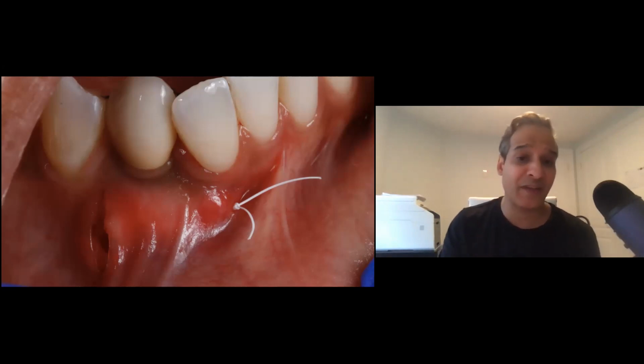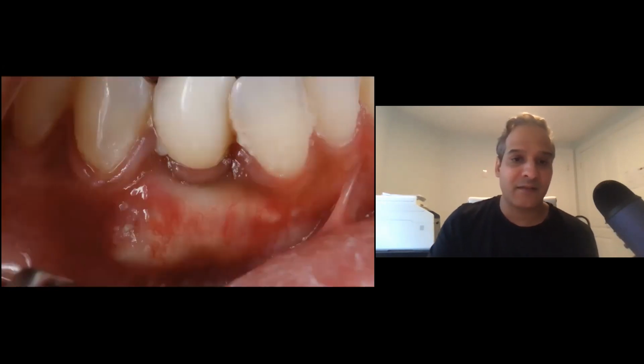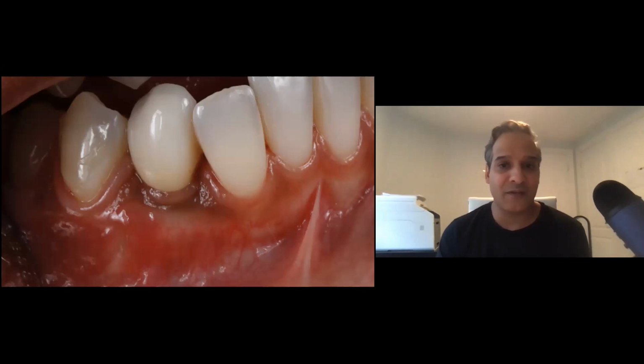And you can see now with that double layer of tissue over the site, it acts like a padding to protect and mask the grayness of the implant. Some sutures just to close up the incision line. This is the post-op when we are at 2 weeks. And this is once it all matured. So you can see how everything looks. You can see the grayness, all of it is gone. Patient was happy. We didn't have to take tissue from her palate. So we got our result and our intended objective was done.